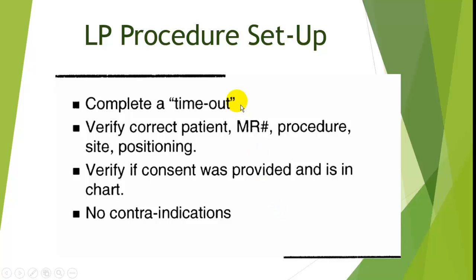And as you get ready, you're going to want to collect yourself, and you want to go down a list. You want to verify that you're performing the procedure on the correct patient. You want to also make sure that there's a written consent on the chart, and that you've gone through that entire list of contraindications and find none. This is one of the situations where doing a sort of pilot before flight checklists to make sure that everything is in order is a good technique.